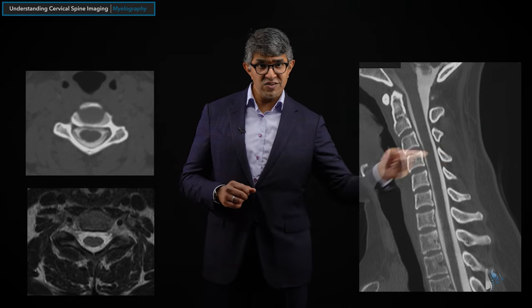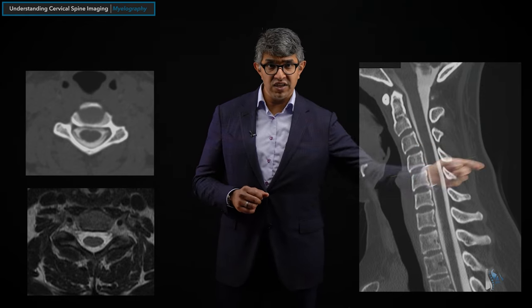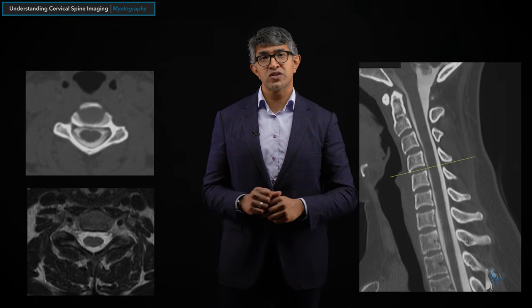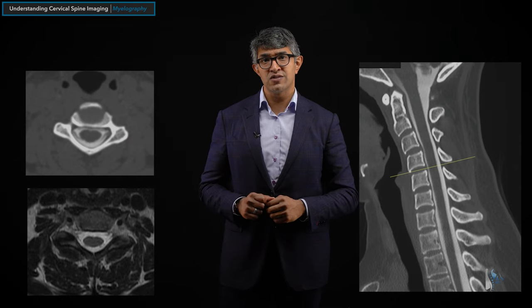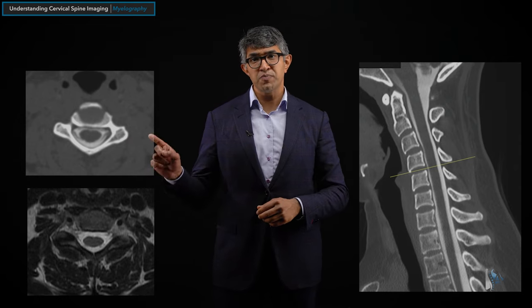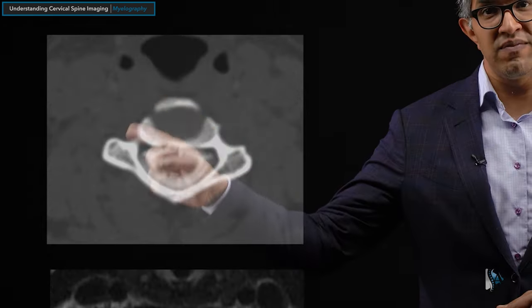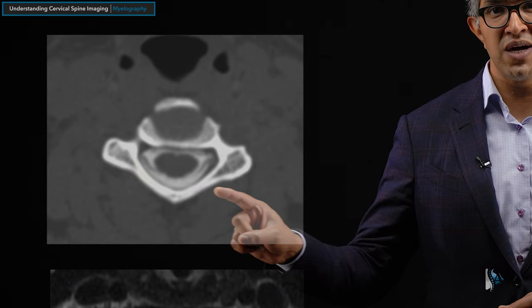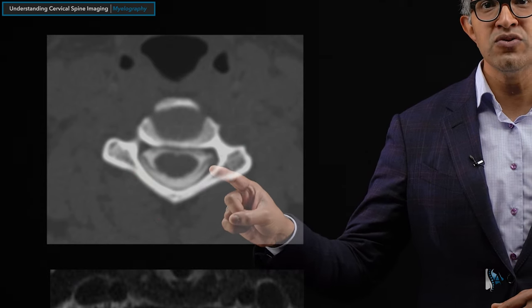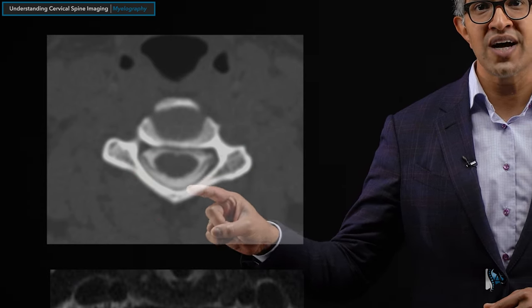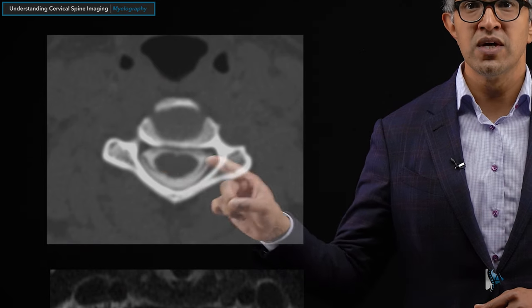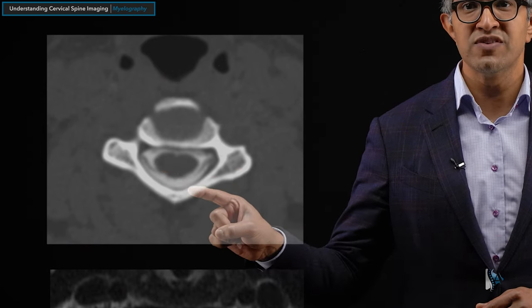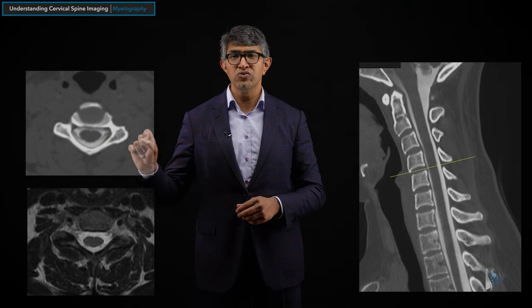When you get a single axial slice — say through the C4-5 level — that will give you a picture that looks like this. You can see the C4 vertebral body, a little bit of the disc space, and a lot of soft tissue structures. Here you can see contrast within the canal surrounding the spinal cord, and you can even see small nerve root fibers.